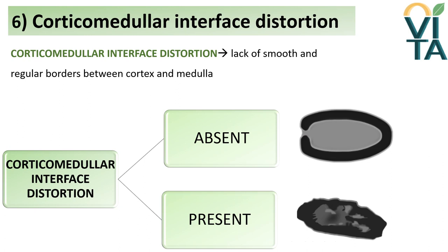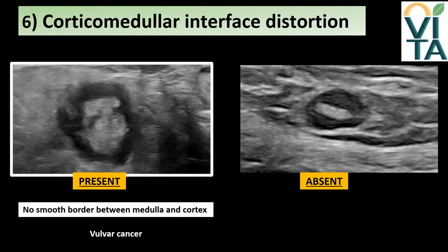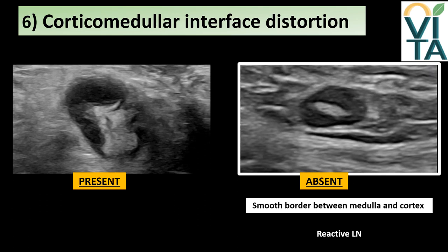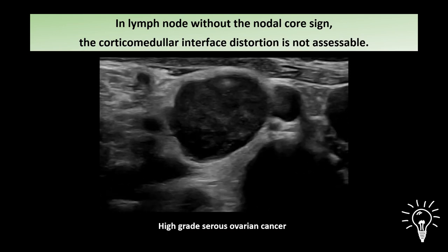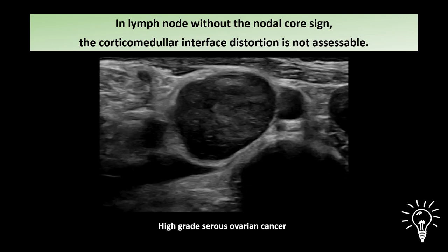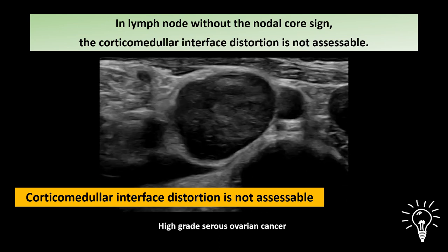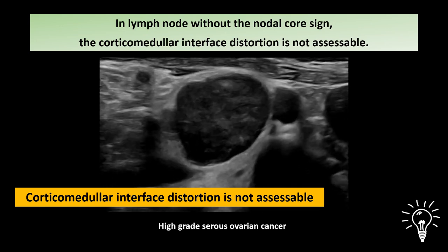Corticomedullary interface distortion is defined as the lack of smooth, regular borders between cortex and medulla. It can be present or absent. The corticomedullary interface is clearly distorted in a metastatic lymph node from a patient with vulvar cancer, while a reactive lymph node shows smooth borders between medulla and cortex. Importantly, corticomedullary interface distortion cannot be assessed if the nodal core sign is absent — in this lymph node without nodal core sign due to infiltration from high-grade serous ovarian cancer, it is classified as not assessable.